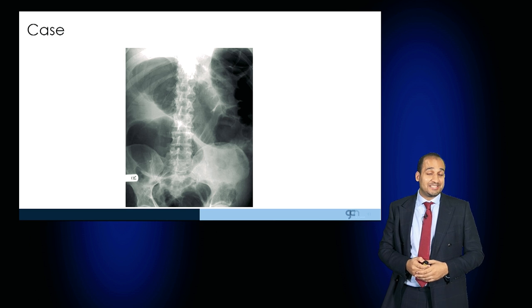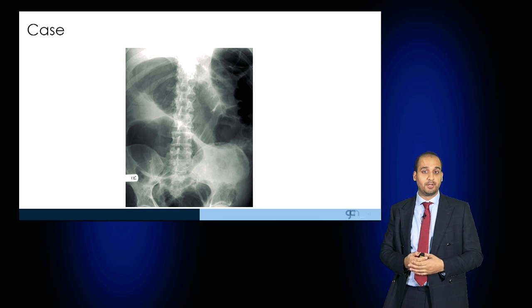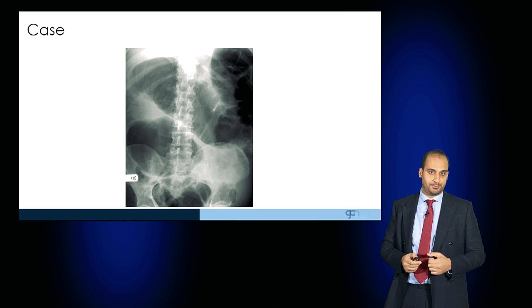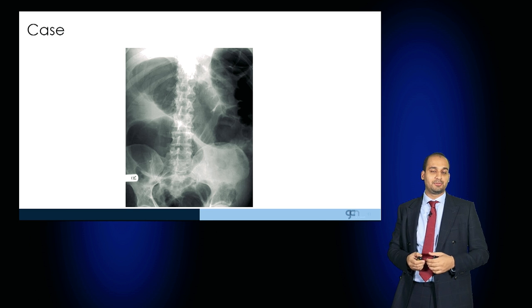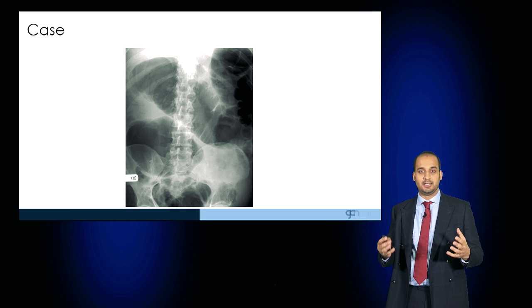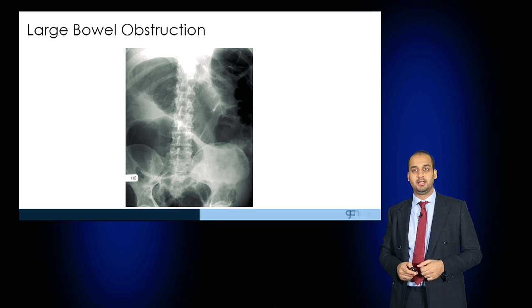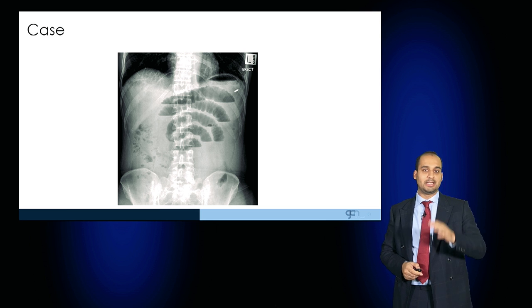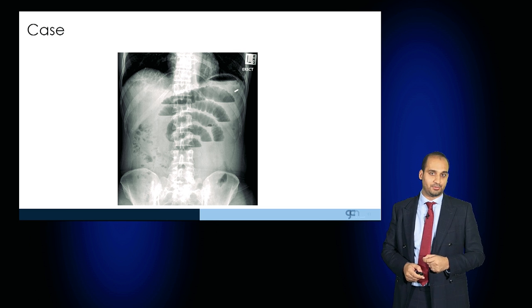You may be asked to see a patient with abdominal pain and you organise an abdominal radiograph. What you can see here is large bowel obstruction — in the large bowel there are haustra which are non-continuous lines, and this peripherally dilated large bowel is the result of a proximal obstruction. Compare that to where the lines are seen going all the way across — this is small bowel obstruction.